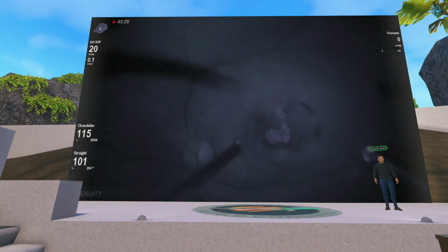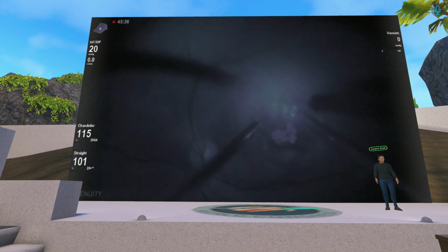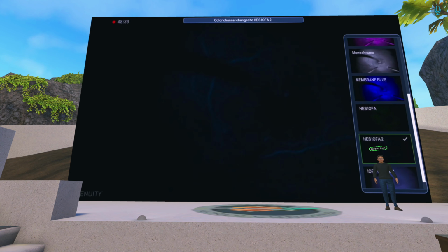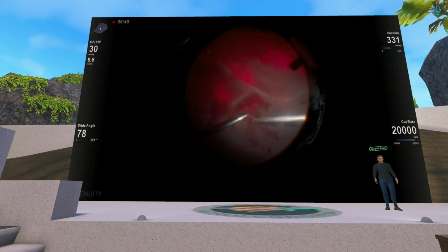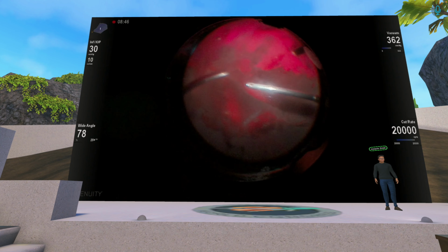This case was a case of sub-retinal hemorrhage. We were not sure if it was a neovascular membrane or where the hemorrhage came from. So with Intraoperative, you can notice that there's a leaking macroaneurysm in the macula that was responsible for the hemorrhage. This is our last case, probably the most interesting one.